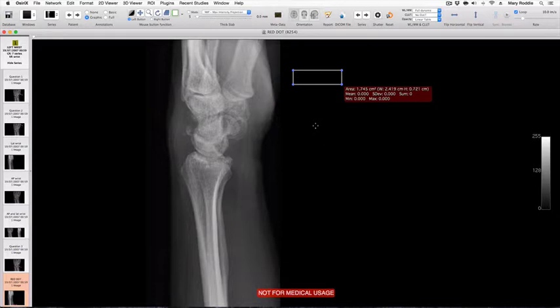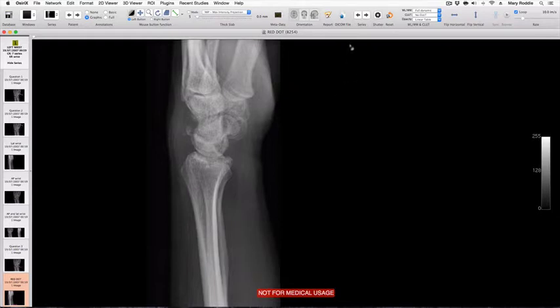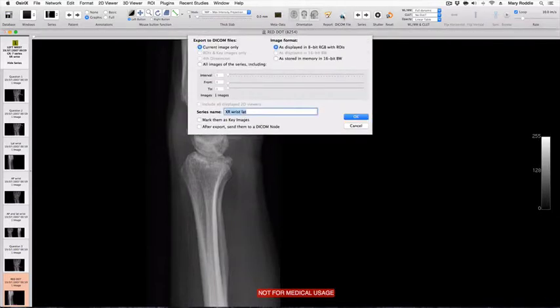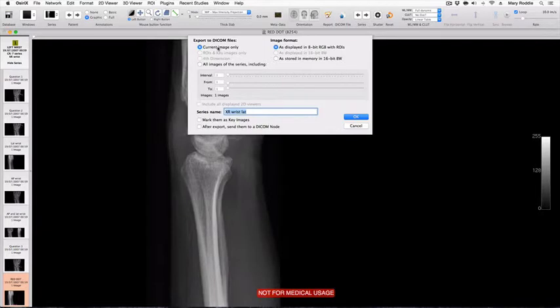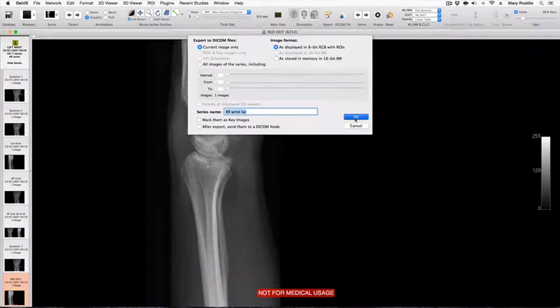To get rid of the white box, simply backspace. We can now export this as a new DICOM file, current image only, as displayed in 8-bit RGB with ROIs and called X-ray wrist lateral.